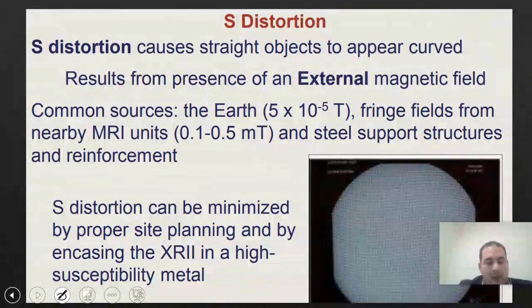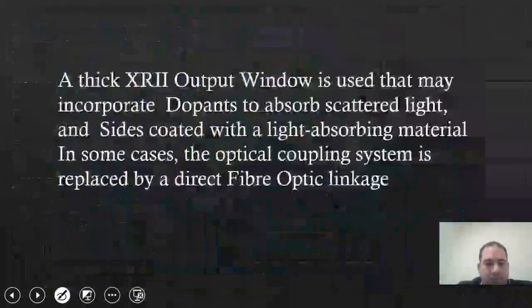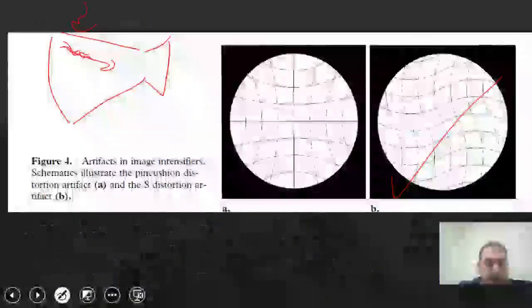Of course, this topic requires attention to the image intensifier as well. For example, if someone has a machine, whether it's an X-ray machine or a fluoroscopy machine that has an image intensifier, they must ensure that there are no external sources affecting the area being examined. It can affect, for example, the nearby units, so there must be a specific magnetic field. All of this needs to be considered in the planning or in the design of the machine itself from the beginning.